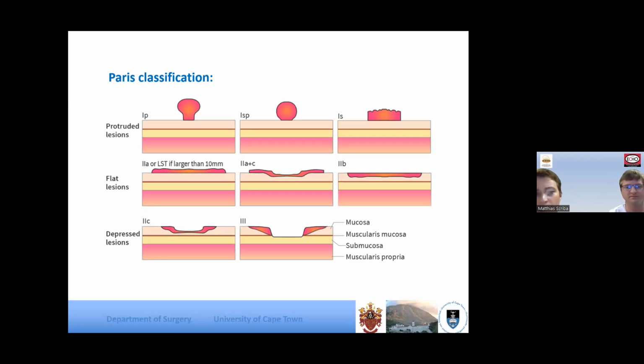I do think you need to be able to speak the language, and to do that, you should be able to describe your polyp, both for yourself when reviewing that same patient on another occasion, but also to describe accurately to colleagues who may scope that patient on another day. I must confess, I don't remember the Paris classification offhand and prefer to use descriptive words, but you should know about it, especially if you're going to be writing your exam soon.